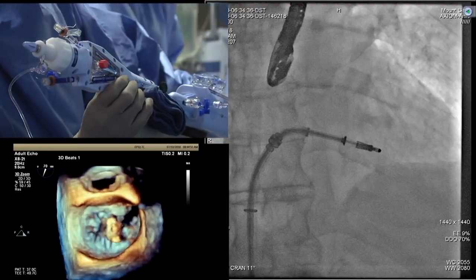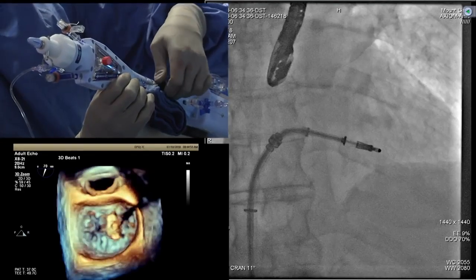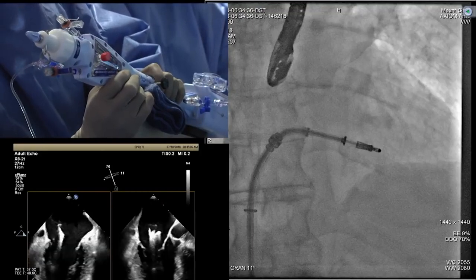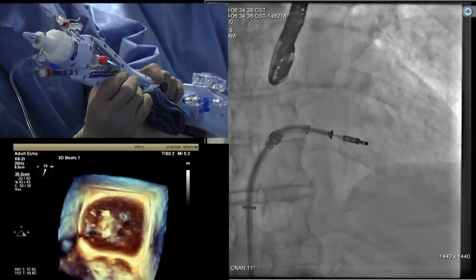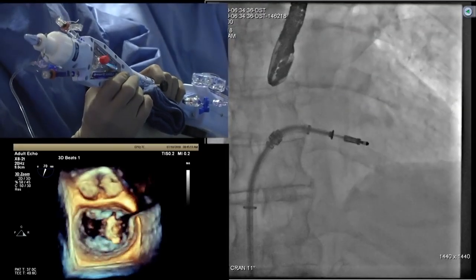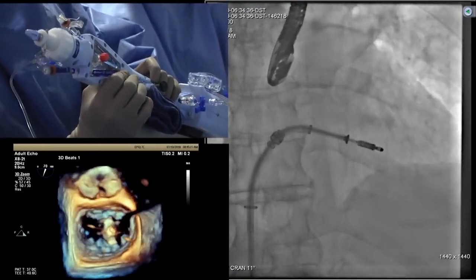Gilbert, I think maybe a little more clockwise. A little bit more what? Maybe a little more clockwise rotation. Look at it. A little more clock. No more clock. On the 2D. A little bit more clock? Hila, you're saying clock more? I think a little bit more. What they're trying to achieve is really a 12-6 position. Yeah, 12-6. But okay, now I think we're good now. 12-6. Yeah, I think that's better. Looking good there. I think we're good now. Okay, that's good.